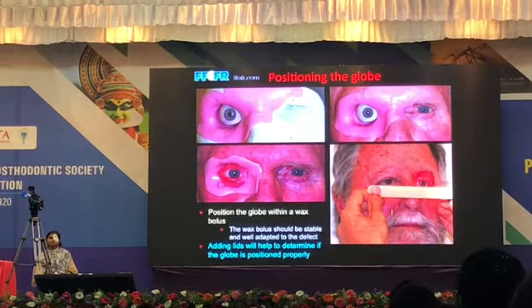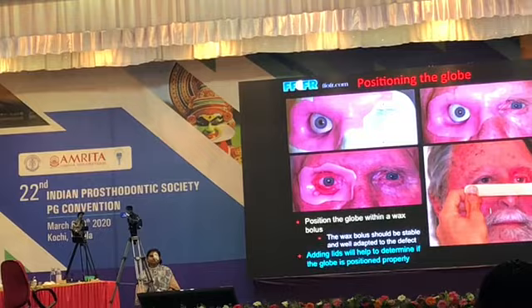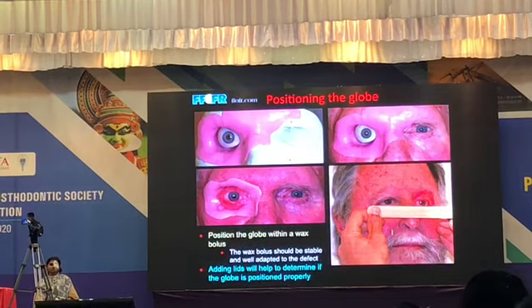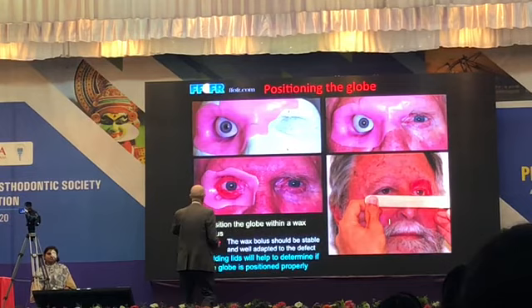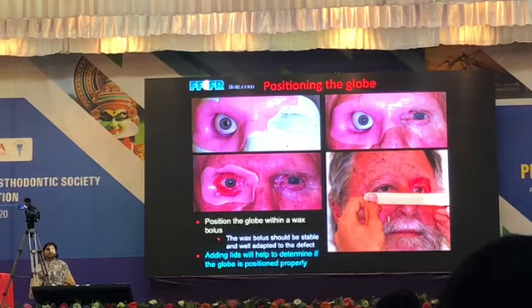So at any rate, the globe has to be perfectly positioned. And then you want to look at it from various perspectives. You don't want to start sculpting, doing a lot of lid sculpting like this, until you've got the globe exactly where you want it. And so the first step I like to do is to just apply a little bit of wax to create the semblance of lid. That also is helpful in determining whether the globe is in the right position. And once I've determined that it's in the right position, then you can add the rest of the wax and develop the contours of the soft tissues. But you don't want to do that until you've perfectly positioned the globe.